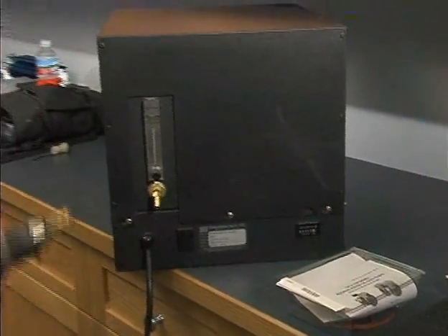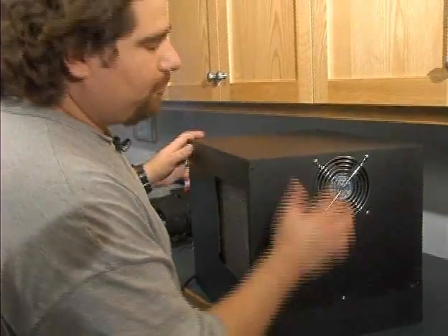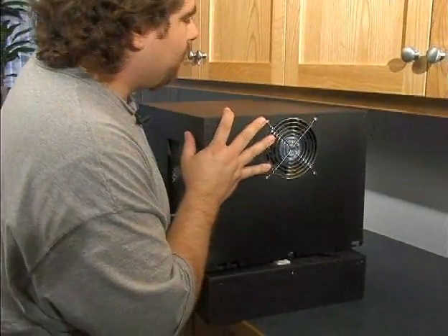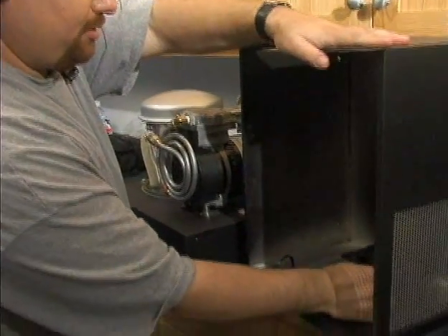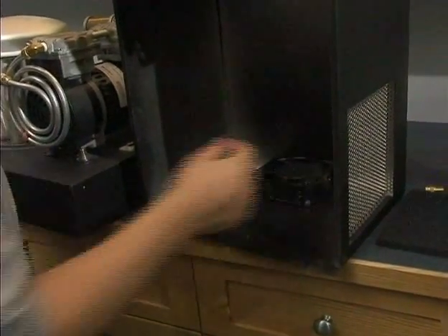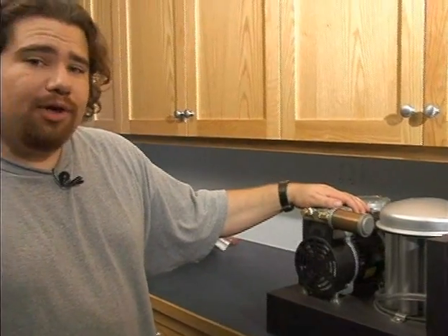First we remove the cover — there are three screws, front and back. On the removal of the cover, there is a fan here with a cord that we want to make sure you disconnect properly. Just simply pull it off and set the cover somewhere else.